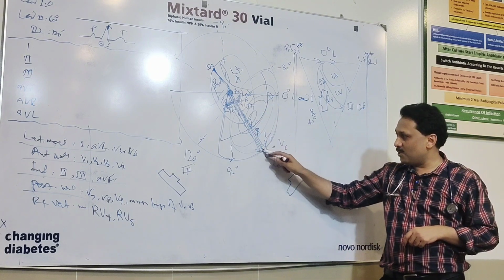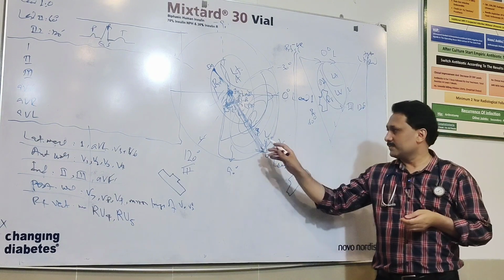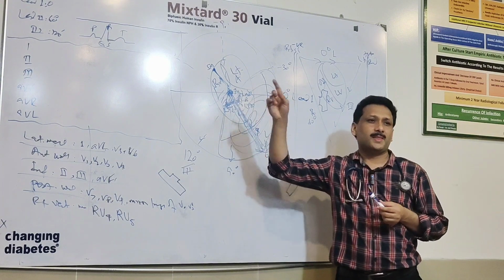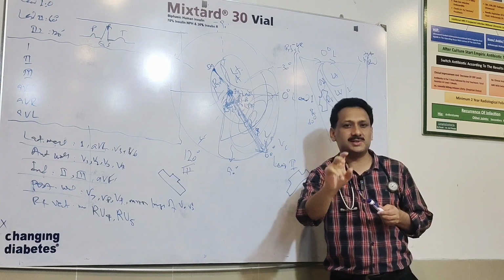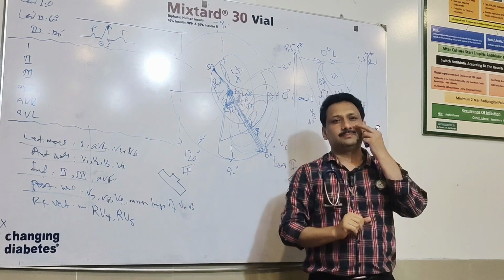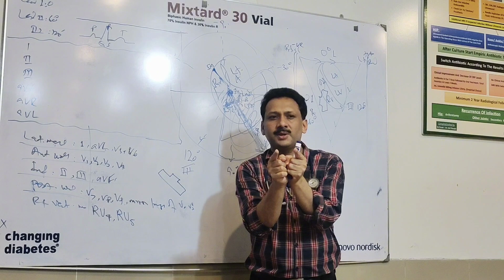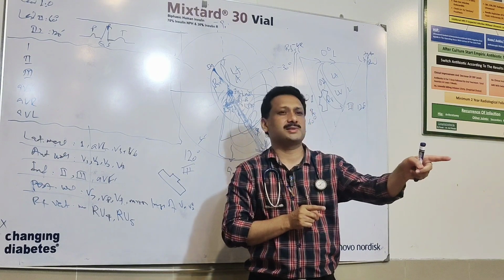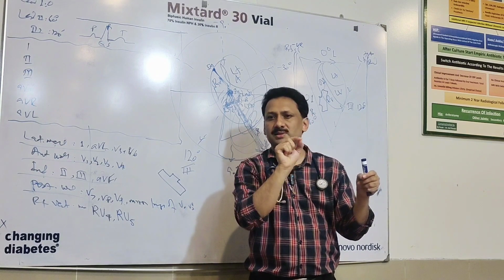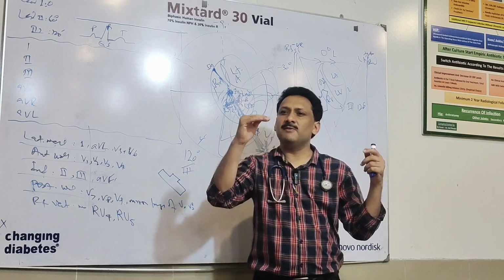The flow of current, the maximum flow of current is in this direction. This is the normal cardiac axis. Now, remember this sentence, memorize this sentence. If the direction of flow of current in a human being is towards that normal cardiac axis, the deflection produced by that stylus over that ECG paper will all be positive. In other words, it will be above the baseline.